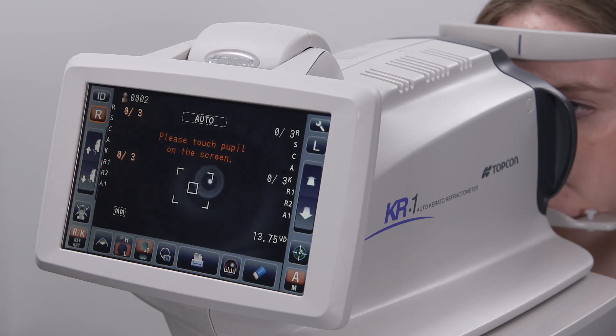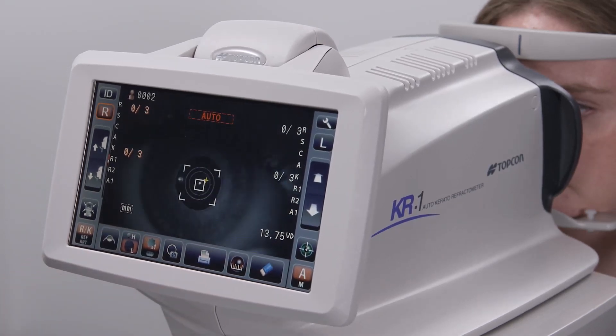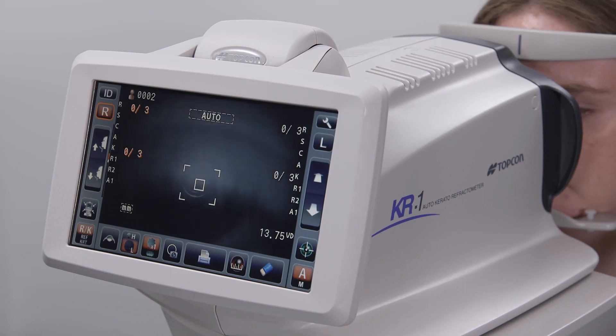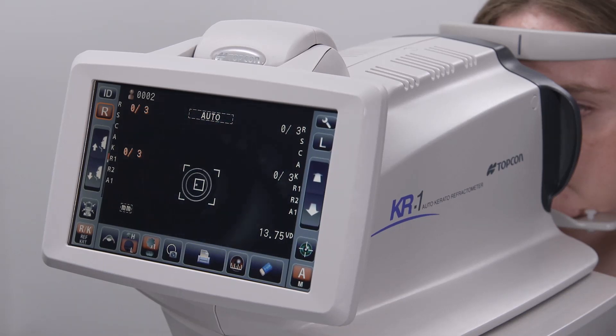Instruct the patient to look at the target image, but to keep their eyes wide open between blinks. Tap the center of the pupil, and it will move to the center of the screen in autofocus. Once the image is centered and focused, the device will begin acquiring measurements automatically.